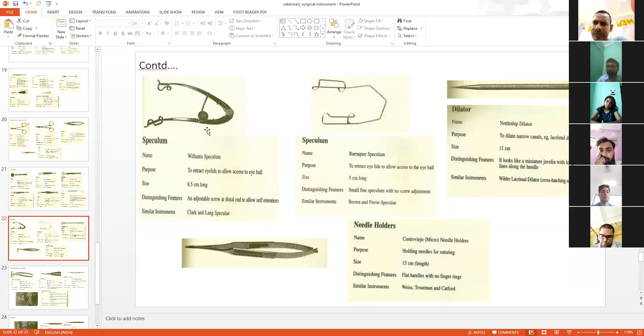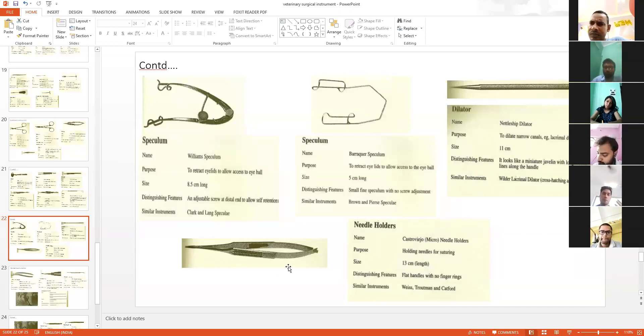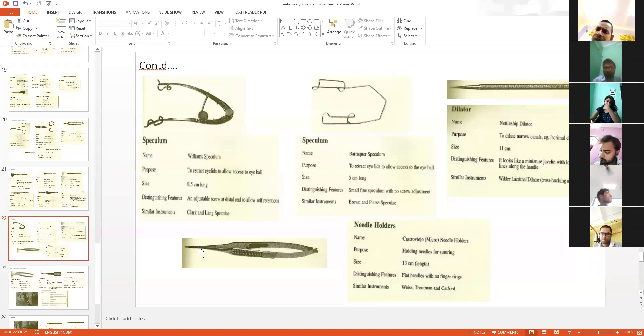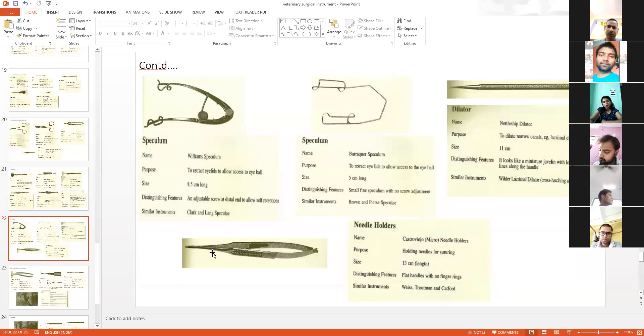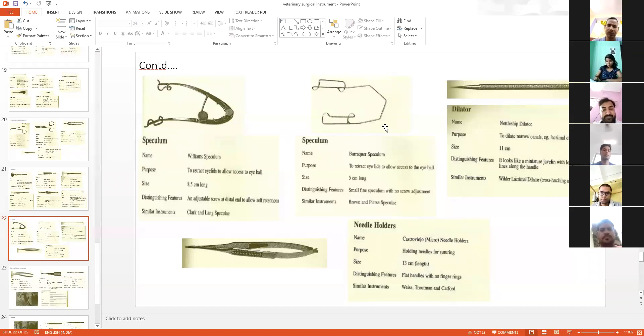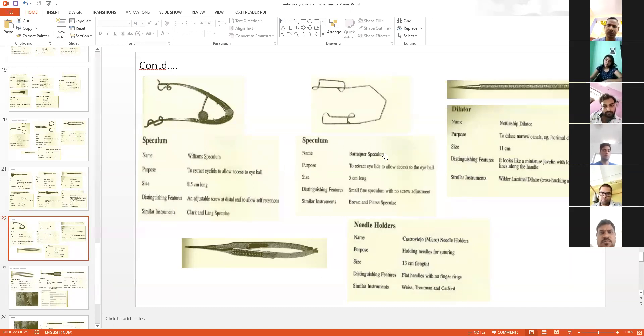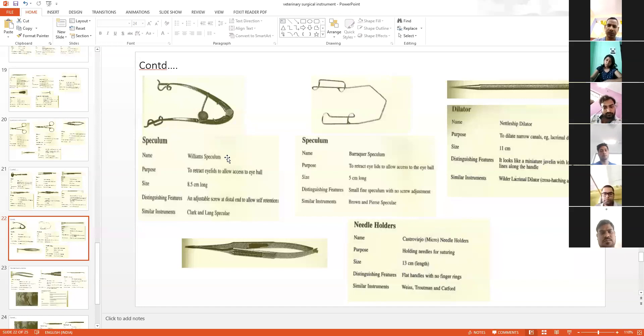This is known as an eye speculum. I am not going to ask you to write the specific name of this instrument, like Barraquer speculum or other systems. Simply, if you write 'eye speculum to see eyeball,' this is sufficient.